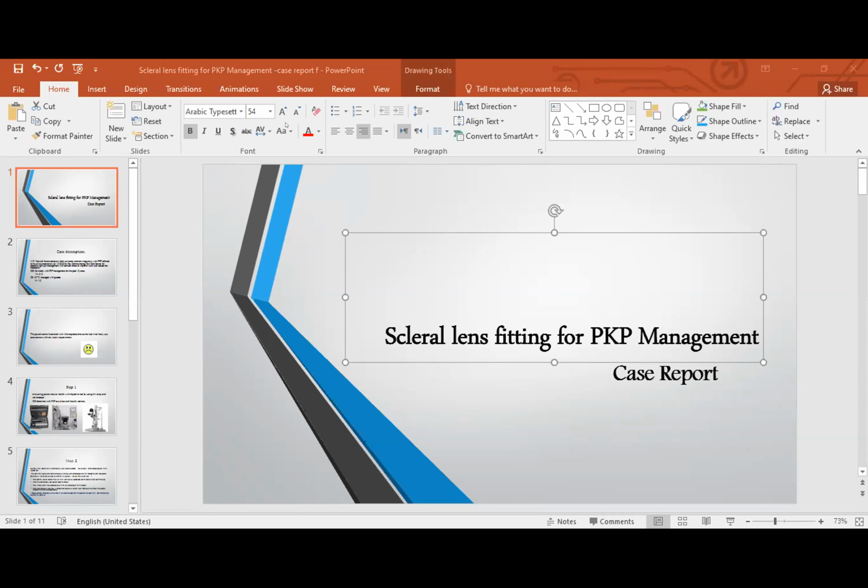By the angle of wettability, as you may know, Randy, the Boston depends more on a coating rather than the Contamac Extra. So to maintain the wettability, and for durability, I would assume Boston has better durability in my experience.